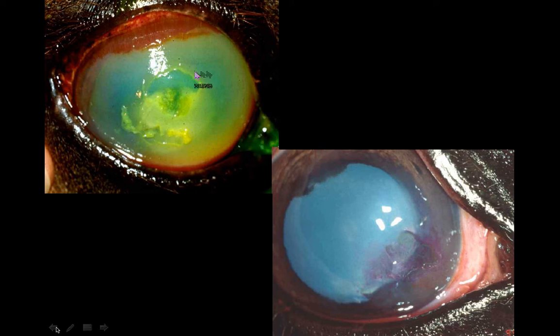The horse here on the left, you can see it's got a fluorescein positive staining. We have some nice blood vessels coming in. It's a fairly diffuse ulcer at this time, but not very deep, based on the corneal staining and the slit lamp evaluation.